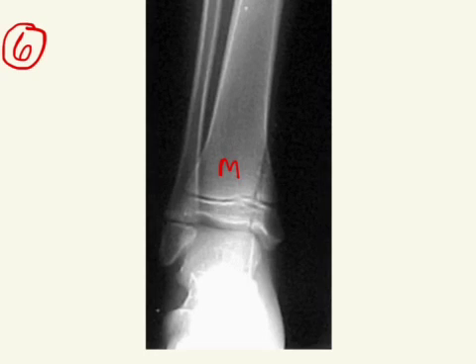Now again, here is your metaphysis and your epiphysis, and you can see that there is a line that goes through both of them here. So the fracture goes through both, and so if it's through and through, that's a Salter-Harris 4.